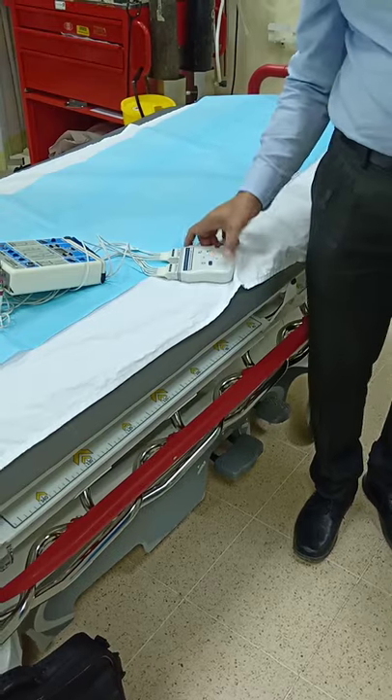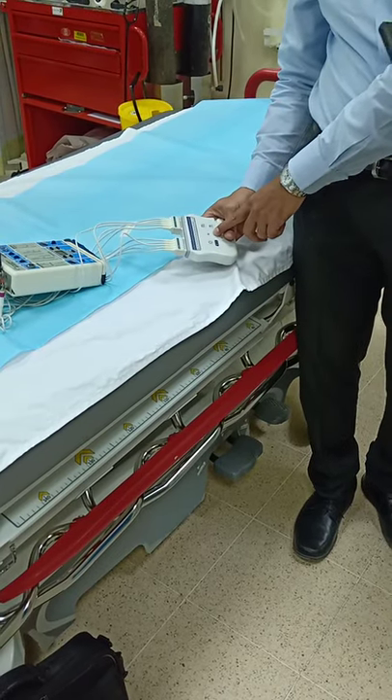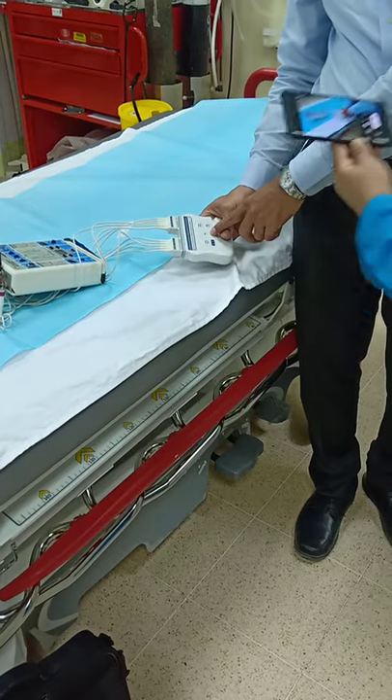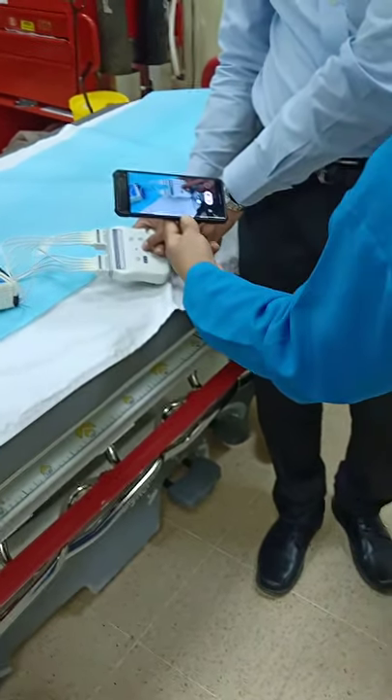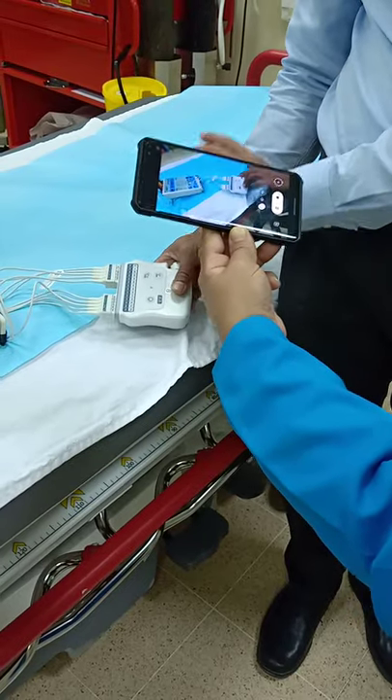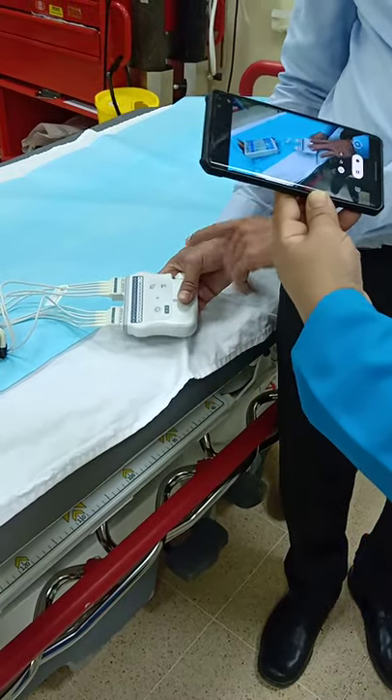Once it is connected to the patient, it will be green. If any lead is off, it will be orange. And if it is completely disconnected from the patient, it will be red.